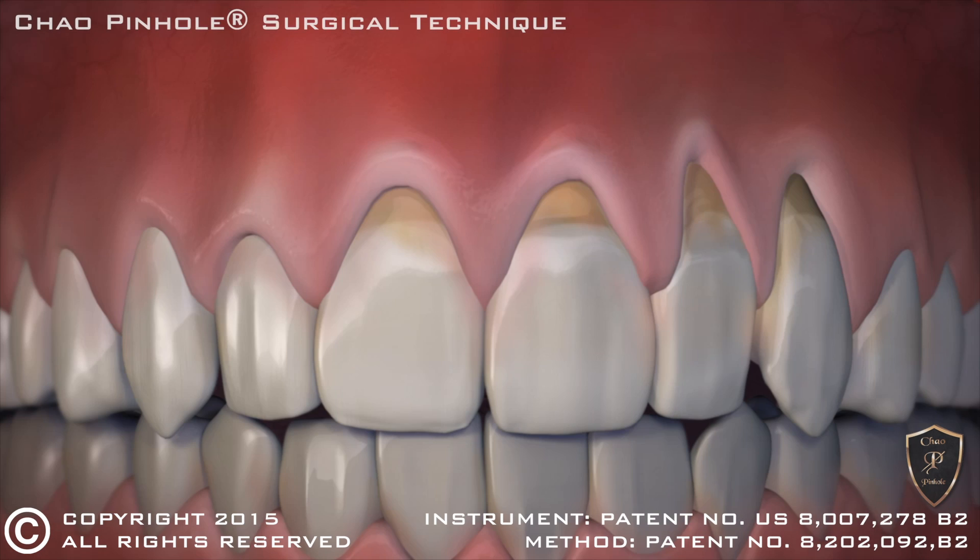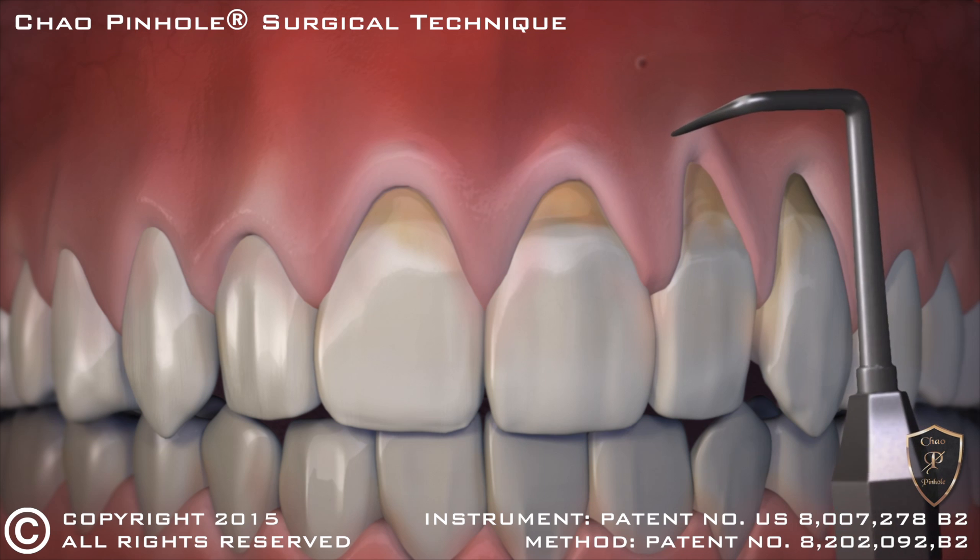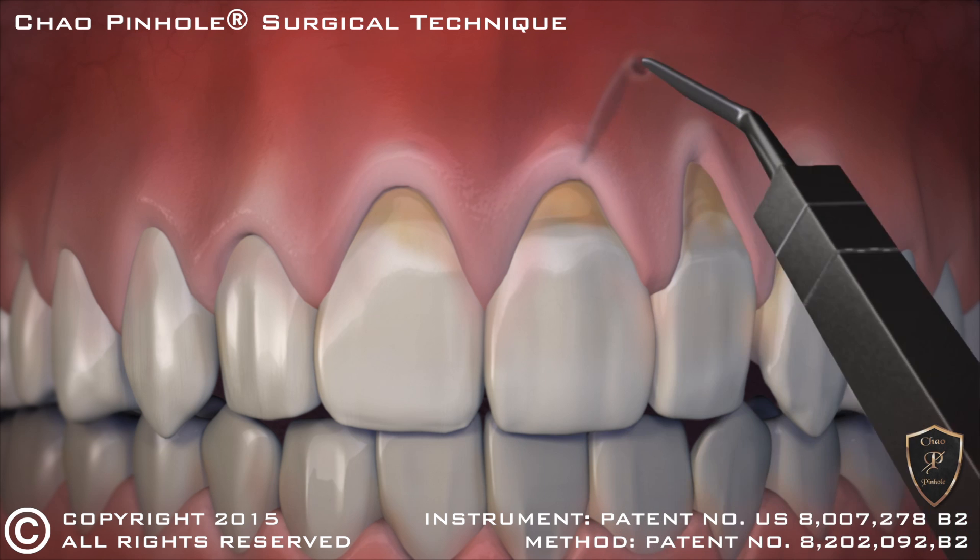Now, with the new revolutionary Chow Pinhole Gum Rejuvenation, gum recession is corrected without cutting or stitches. This new process begins with a tiny entry point that is made in the gum. Then, a special dental instrument is placed through the pinhole to free the gums with gentle movements.